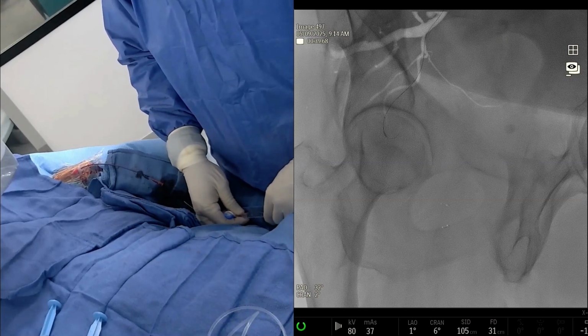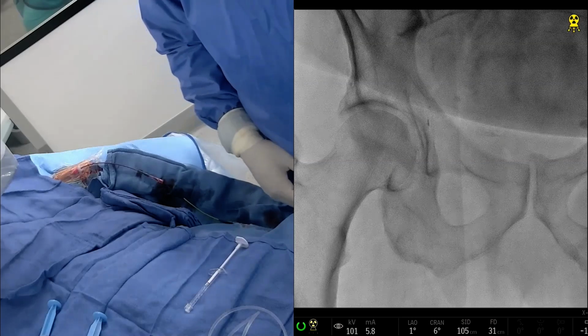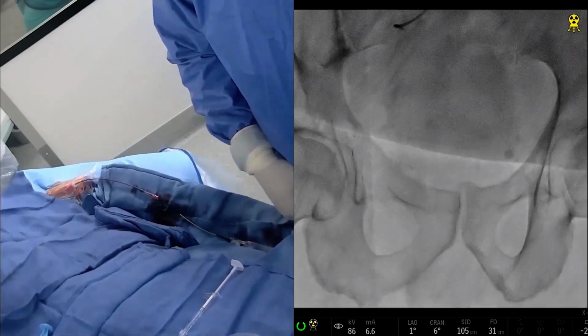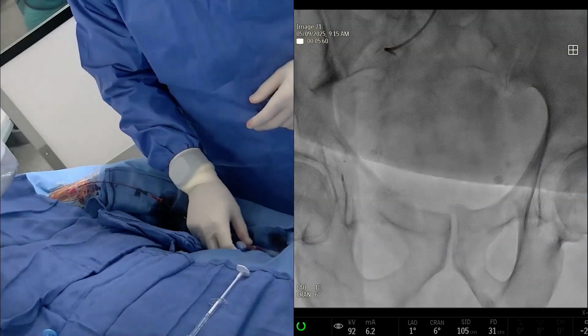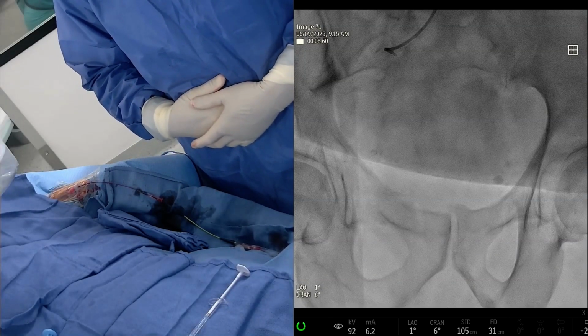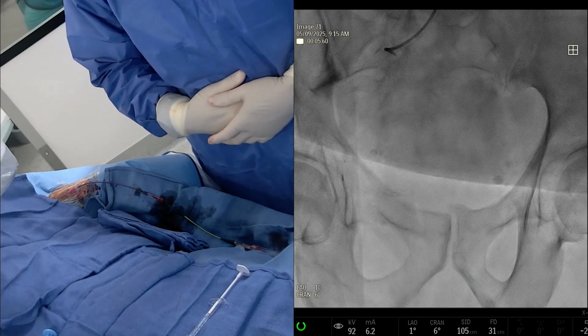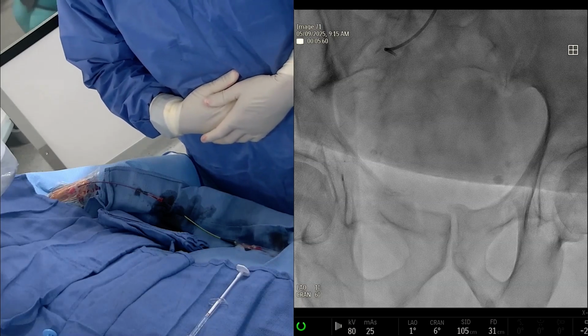Yeah, so I was going to ask you what microcatheter you chose, and how do you choose your microcatheter depending on the anatomy? Yeah, I was going to ask you guys before we did this, but we wanted to just keep working while you were talking. We picked a Sniper microcatheter, which is the microcatheter with a balloon tip, and we'll show why we chose that in a second.